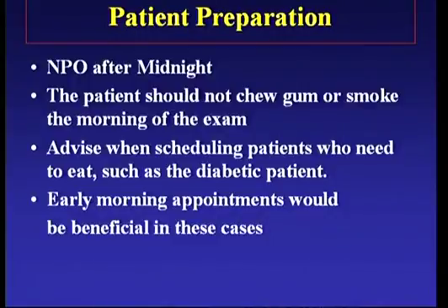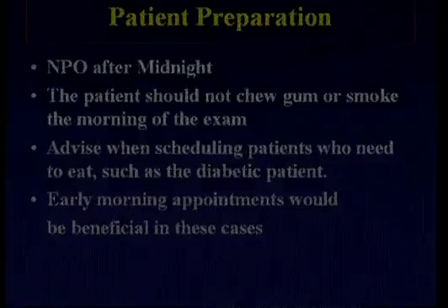To prepare for the examination, the patient must be NPO after midnight. The patient should not chew gum or smoke the morning of the examination, as this exacerbates the production of bowel gas. Be sure to advise patients who need to eat, such as the diabetic patient. In general, early morning appointments are beneficial in these cases.